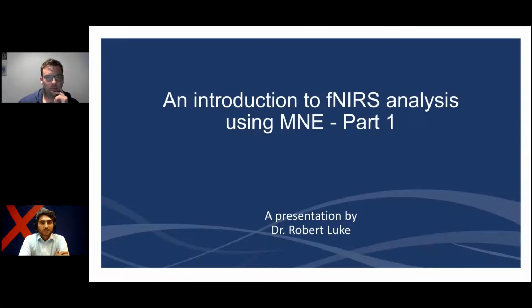Okay, hey everyone, welcome to this webinar. This is a slightly different one. This will be an introduction to fNIRS analysis using a relatively newer toolbox called MNE.